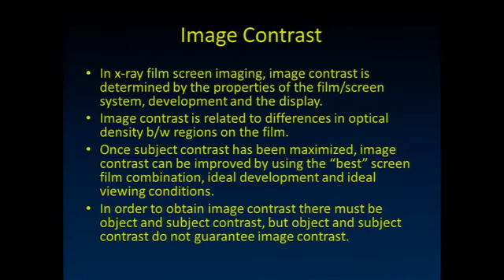Now, in the screen film imaging days, by the way, anyone in the room still use film for anything? In 2015, I think 5% of the country was still doing screen film mammography. My guess is no one's going to raise their hand and say that they're using any screen film for anything right now. Yes? Someone? Okay, so still some people are, right?